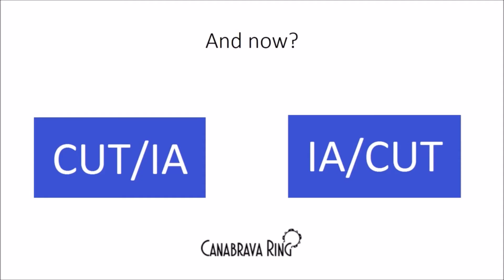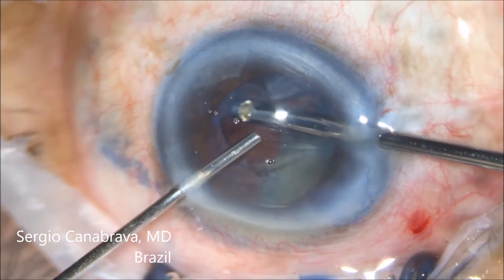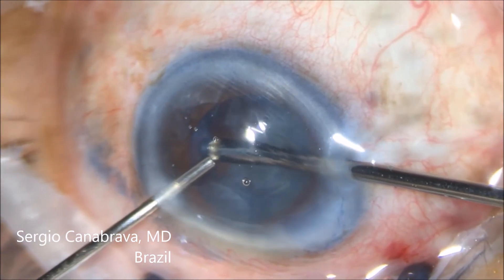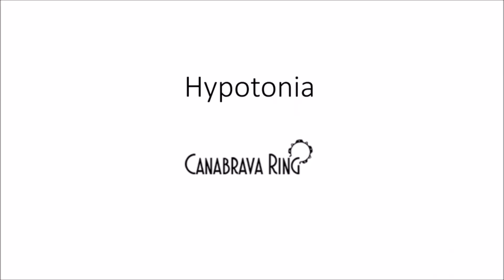Once you finish the vitrectomy and everything is clean, you can now switch to IA-cut mode. If you use IA-cut, you can first aspirate the cortex, and if necessary, press the foot pedal further to start cutting again. Hypotonia is a difficult problem in posterior capsular rupture.